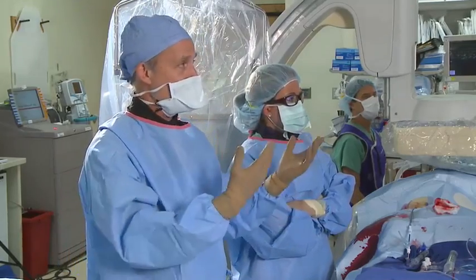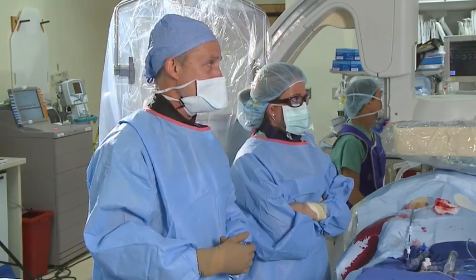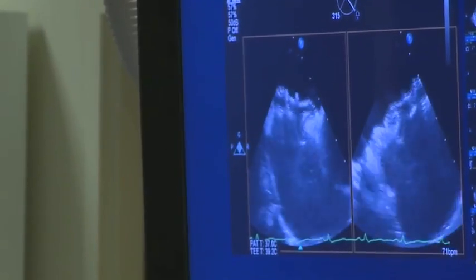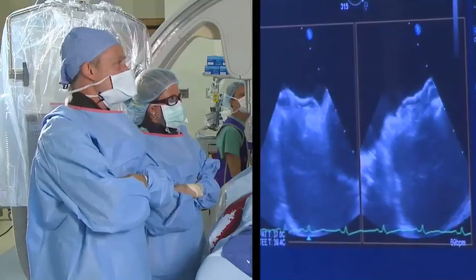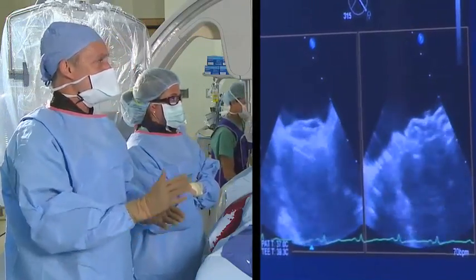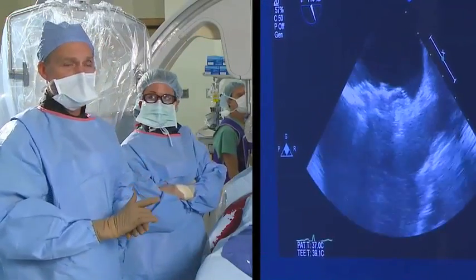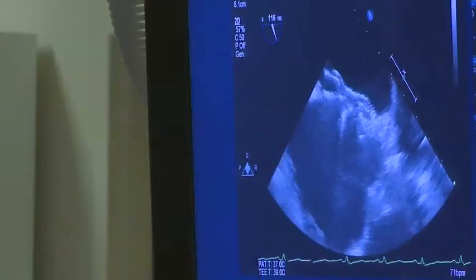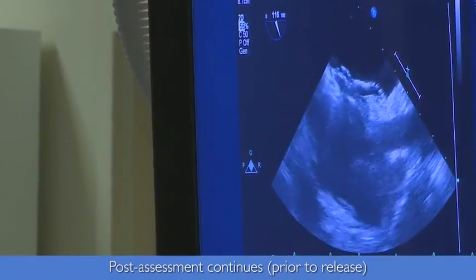So we just sit back here and all look at the images as he interrogates the device anatomy interaction. The device looks nice and flat already, even with the cable attached. So the closure really takes three steps. The first is the pure mechanical of putting the cork in the bottle. The second is the platelet thrombus within the discs. And then thirdly is the slower process of device endothelialization, which we assume takes place within 6 months because that's the duration of our antiplatelet therapy.